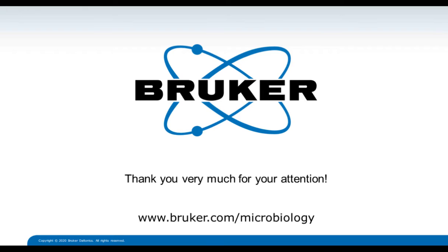Again, a good question. So I understood the first part, how the identification of the IR Biotyper, if that would be applied, compares to the MALDI Biotyper. And here I would say generally for identification, the MALDI Biotyper is the better system because it's very robust, and it also does not need any information about what kind of organism has been used. It's just looking for a similarity match, and is very little influenced by any medium or temperature. So the overall robustness, I think, is just hard to beat.